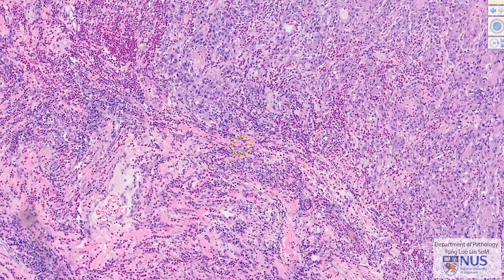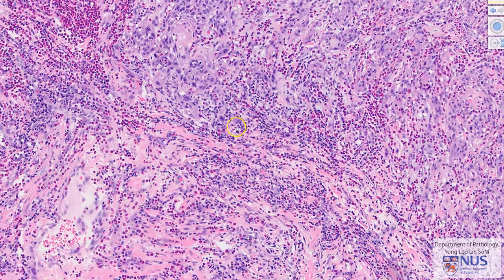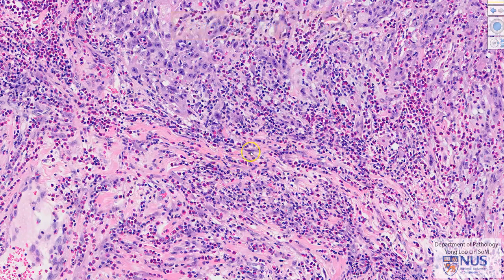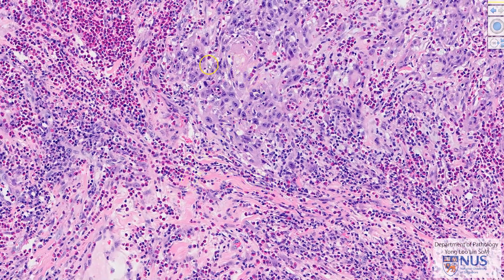Not only is there an inflammatory response, there is also a desmoplastic stromal response. There are more stromal cells, which are spindled and elongated, just around the invading tumor cell nests.